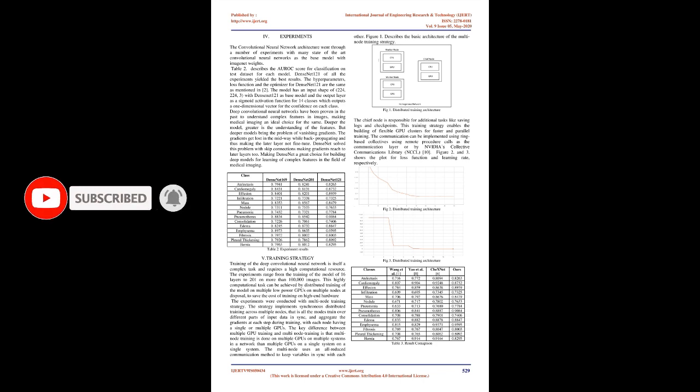The dataset has 112,120 images of frontal chest X-rays of 30,805 patients. The labeled classes in the dataset include atelectasis, consolidation, infiltration, pneumothorax, edema, emphysema, fibrosis, effusion, pneumonia, pleural thickening, cardiomegaly, nodule, mass, and hernia. Table 1 shows the distribution of images per class.